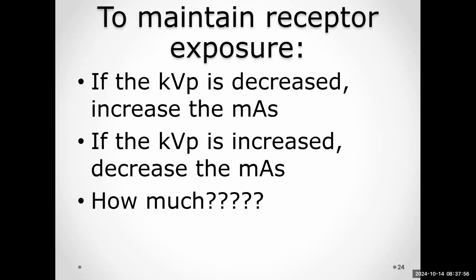So if our goal is to maintain receptor exposure, which is what we did on the practical, right? We were trying to maintain receptor exposure with a change in what for the last practical?